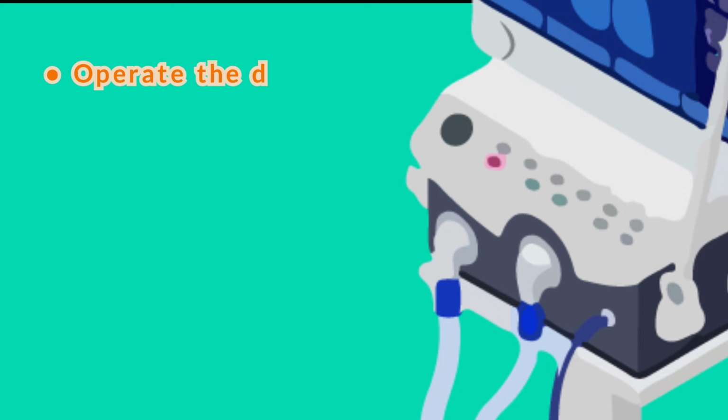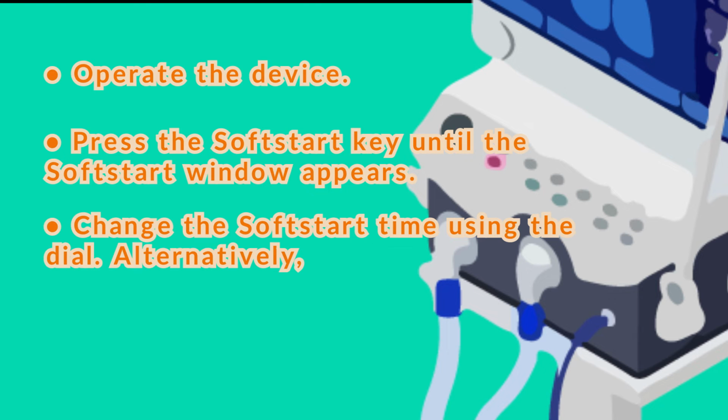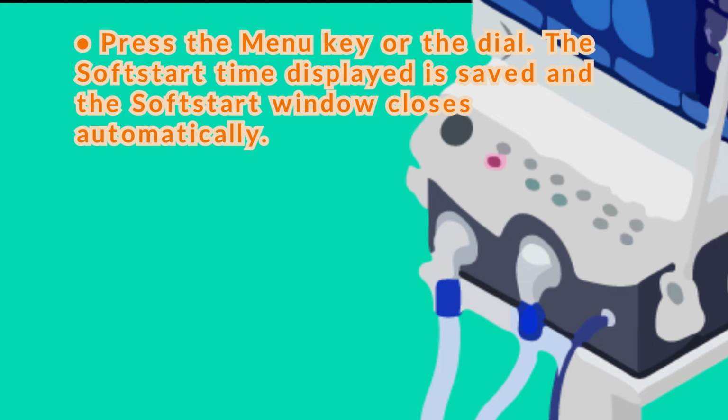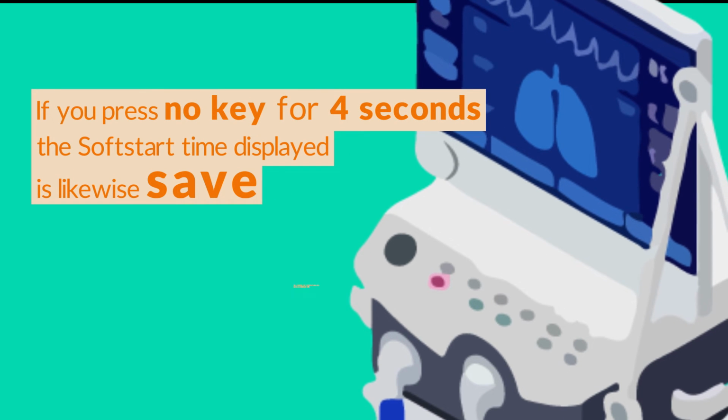Operate the device. Press the soft start key until the soft start window appears. Change the soft start time using the dial. Alternatively, press the soft start key several times in succession to increase soft start time in 5-minute increments. To save the soft start time, press the menu key or the dial. The soft start time displayed is saved and the soft start window closes automatically. If you press no key for 4 seconds, the soft start time displayed is likewise saved.